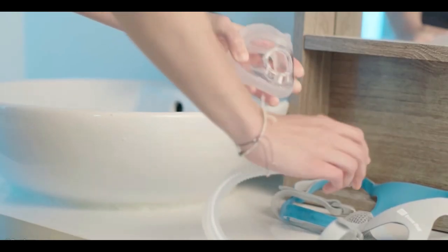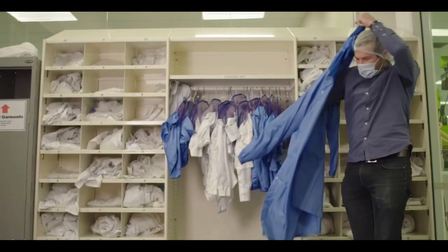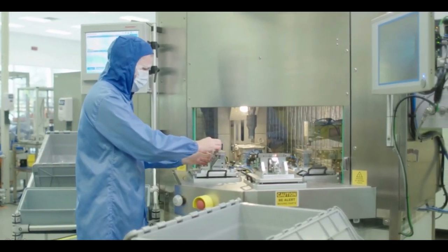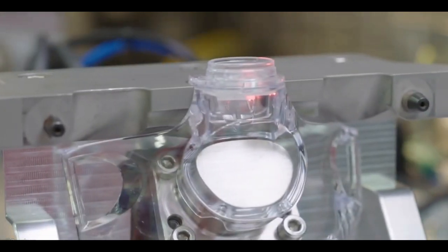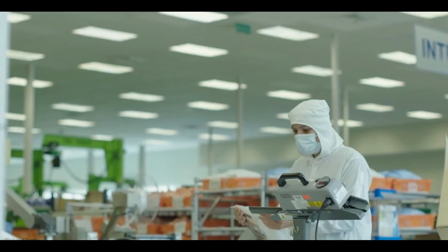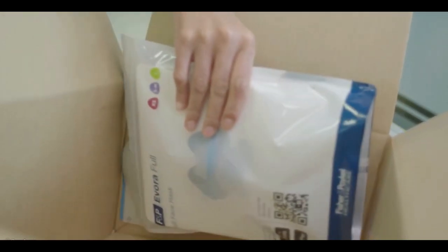In a usability lab we go through how to disconnect and connect the mask, how to clean it, how to set up the headgear in the easiest way, and how patients can put it on themselves. We work with suppliers all across the world looking for the best manufacturing equipment. We have our ultrasonic welding process integrated with leak testing on the frame assembly, ensuring 100% of frames are tested. With a product like Evorafil that's optically critical, we use robots to remove parts from the mold tools and avoid scratches, making the same product consistently so the user experience is the same for all.